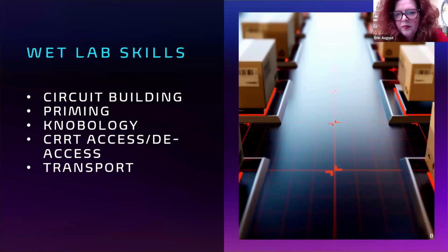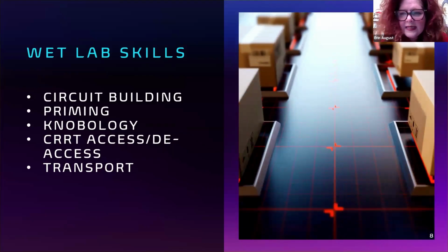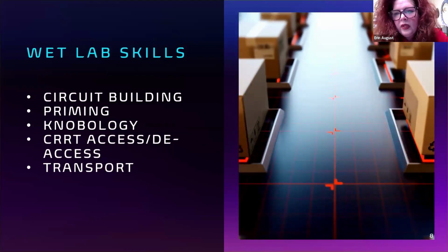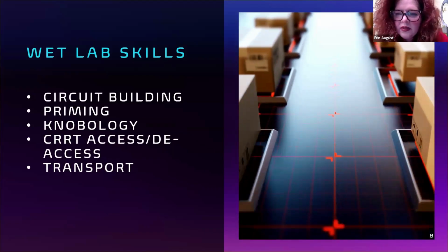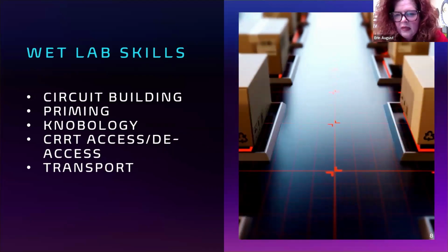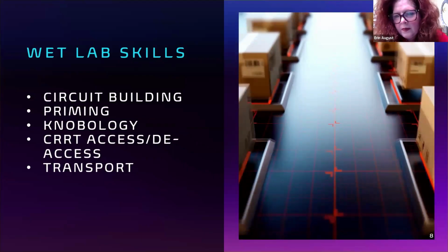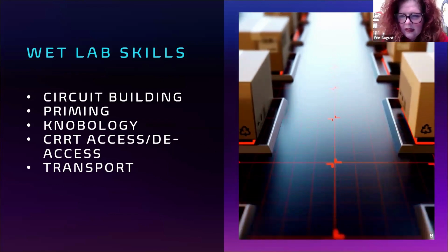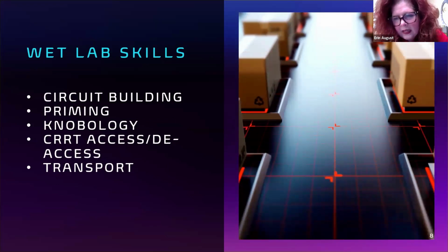So leading into the next one, priming is everything. We want to make sure, because we know all fluid has air in it, so we have to be careful and take our time. We can prime by the way that the manufacturers recommend, but also there's little tips and tricks that we as clinicians can share with each other to make it most effective to decrease the amount of air that may happen when we prime. Going slow, using your clamps and using gravity in the beginning is very beneficial to control and walk air out back up into the bag.